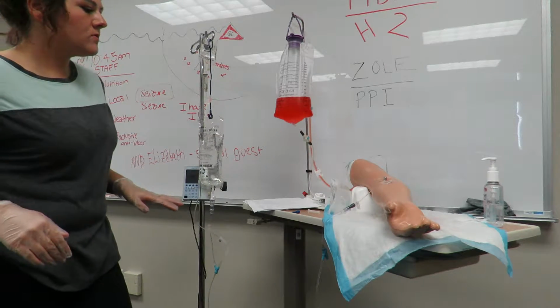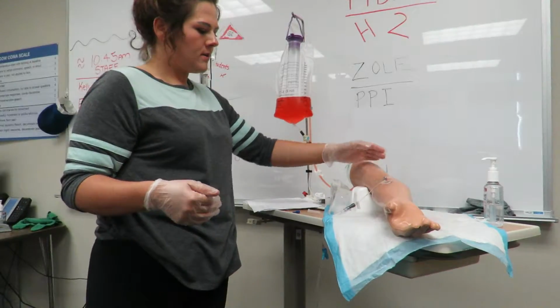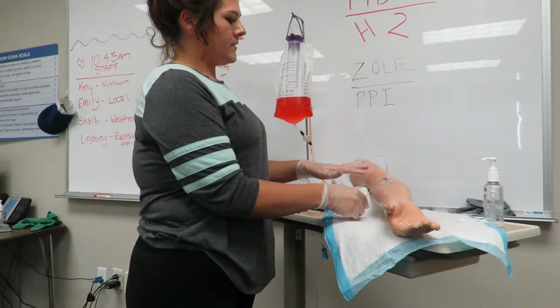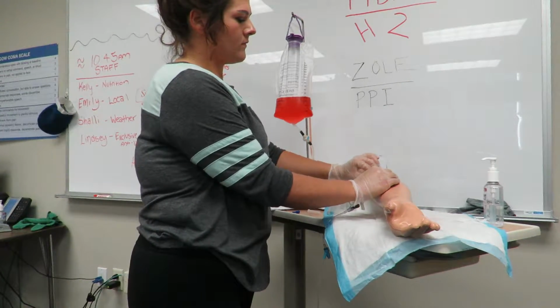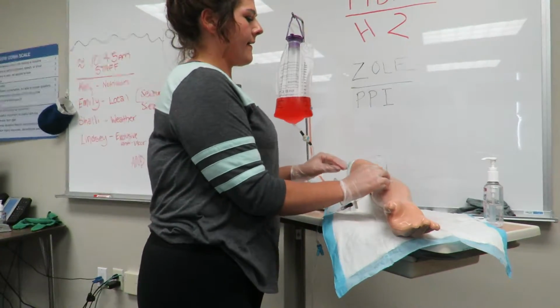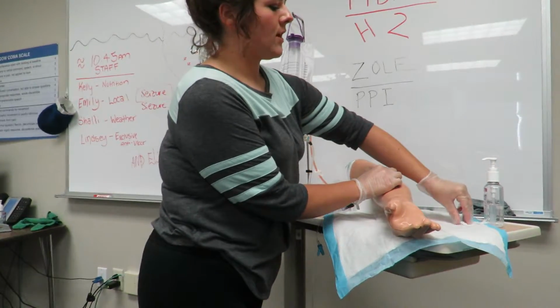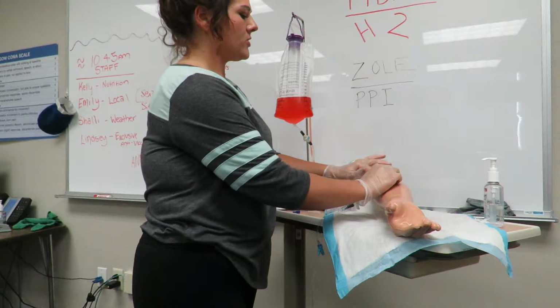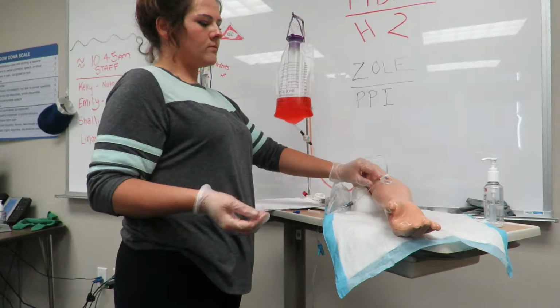All right, and then I'm going to verbalize how I would take off an IV site. I would clamp everything, make sure everything's clamped, and holding the IV site, I would make sure that there's a towel or some sheet underneath here, and then I'd take off the top tape, and holding the IV site in place, I'd grab a sterile gauze and I would hold that and apply pressure and remove the IV, and then hold pressure for 1 to 3 minutes, so 2 minutes.